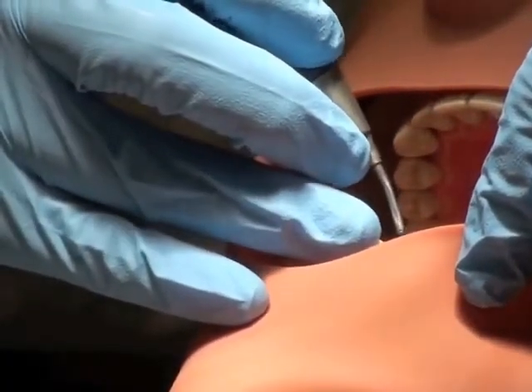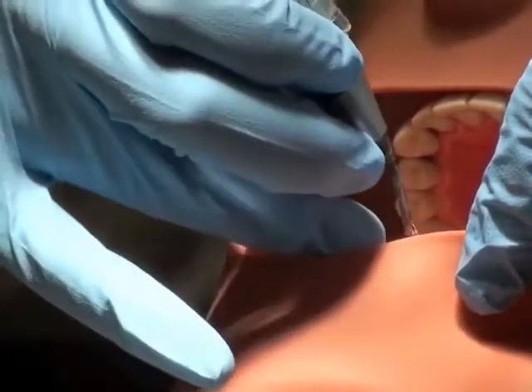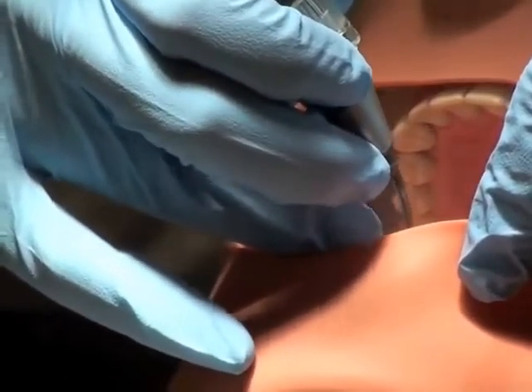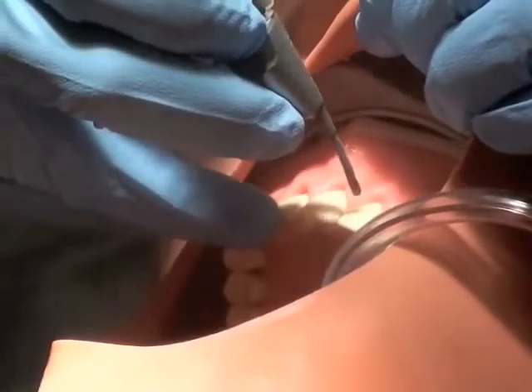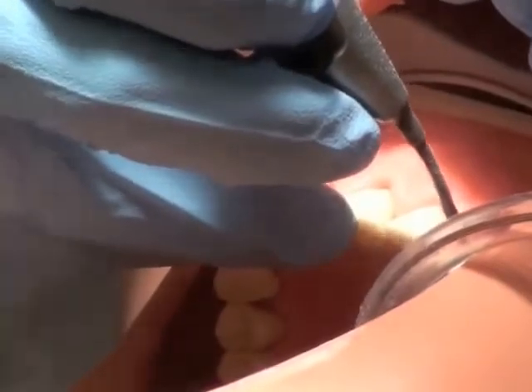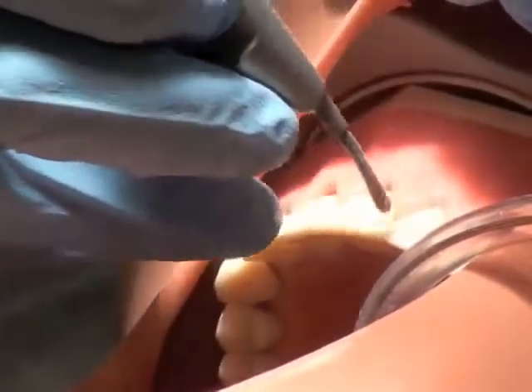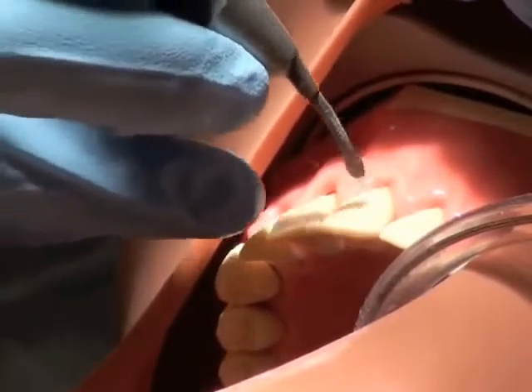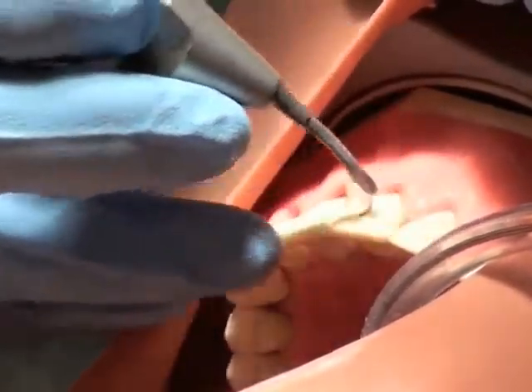The first click of the rheostat expresses water. The second click of the rheostat expresses both powder and water. A good clinician can keep the water inside the patient's mouth, so you'll want to do two or three teeth at a time and then rinse the surfaces that you've completed.